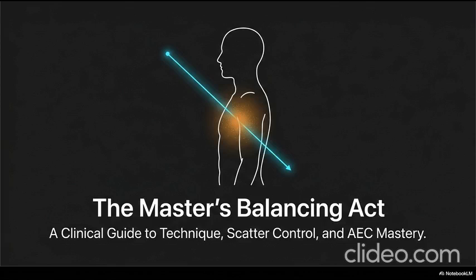Well, the phenomenon is known as digital deception. Digital deception, I love that name, but it sounds bad. It is. Modern digital detectors have an incredibly wide dynamic range, a massive exposure latitude. If you blast a patient with 3 times the necessary radiation, the digital plate captures all of it. But before that image ever appears on the radiographer's monitor, the computer algorithms step in.